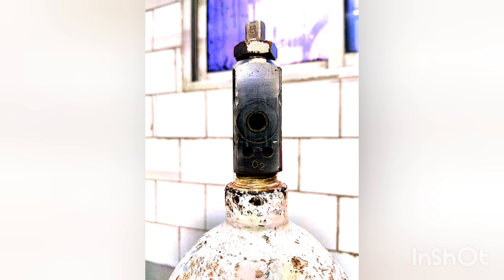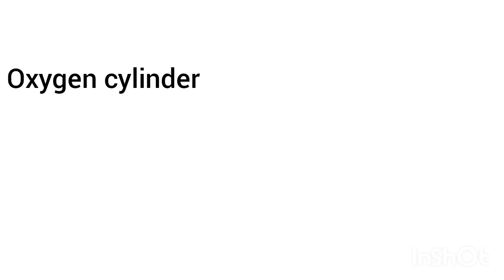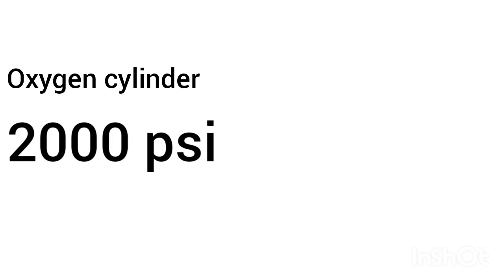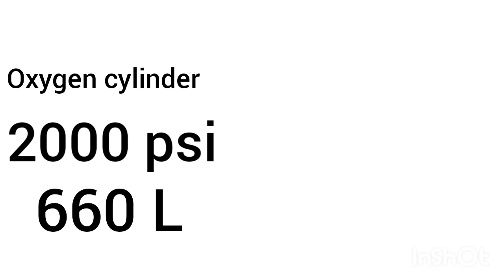Looking into the oxygen cylinder, it has a pressure of 2,000 psi (pounds per square inch), containing 660 liters of oxygen. The pressure in the oxygen cylinder falls in proportion to the content — that is, the oxygen volume. So if the cylinder gauge is showing 1,000 psi, that means there is half of the oxygen in the cylinder, that is around 330 liters of oxygen.